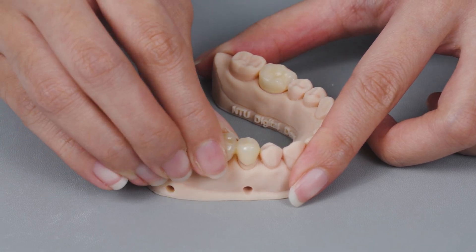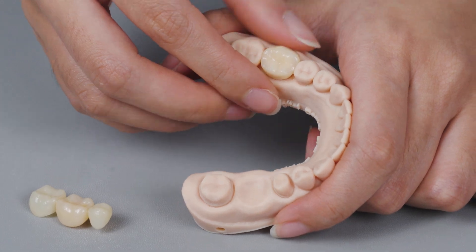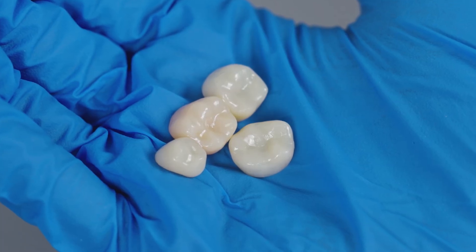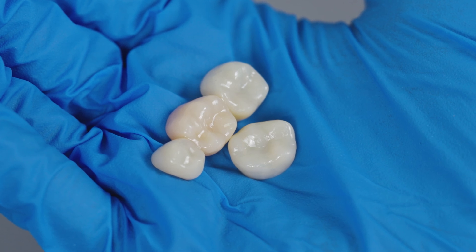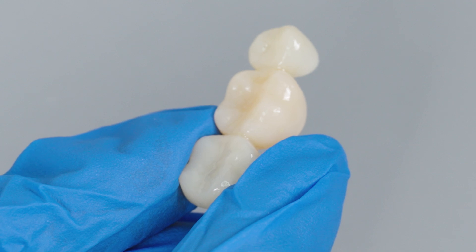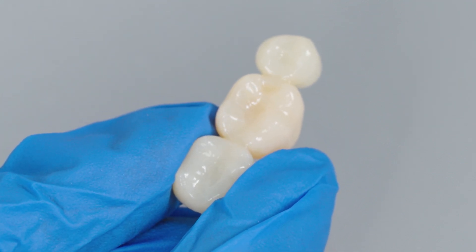In the previous video, we introduced the workflow for 3D printing removable die models using the FrozenSonic series printer. In this video, we will show you how to print crowns and bridges with the same setups. If you are looking to start your own in-clinic chair-side 3D printing to save time and cost, don't miss this following video. Let's check it out!